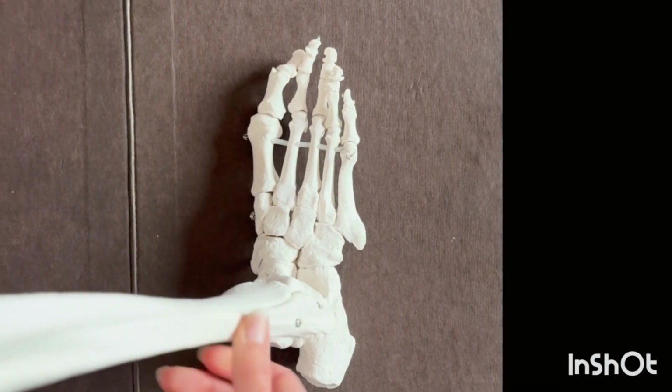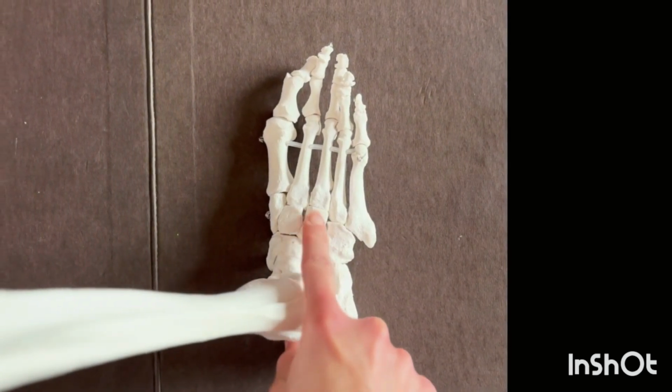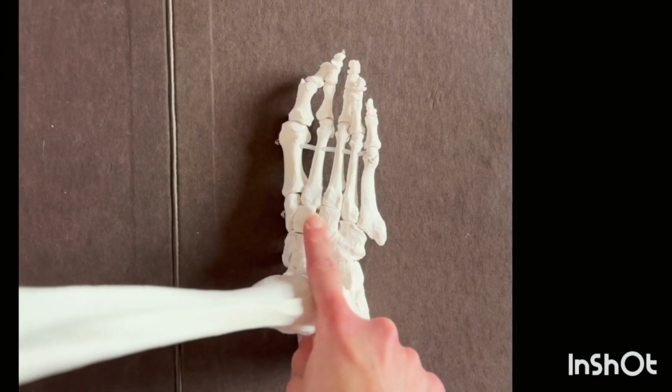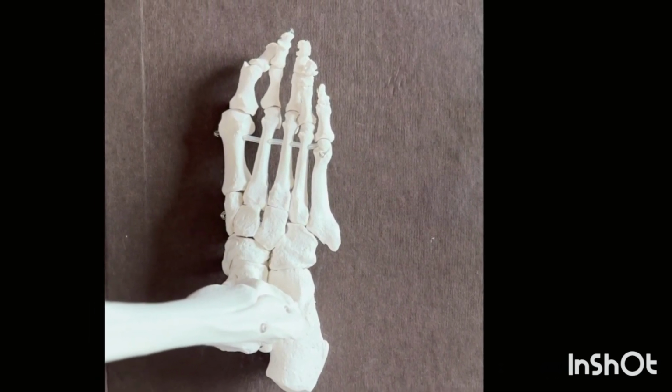The CR will be perpendicular to the image receptor and will be centered at the base of the third metatarsal, which is also the same level as the medial cuneiform. You're going to have a 40-inch SID, and you're going to want to make sure that you shield the patient.